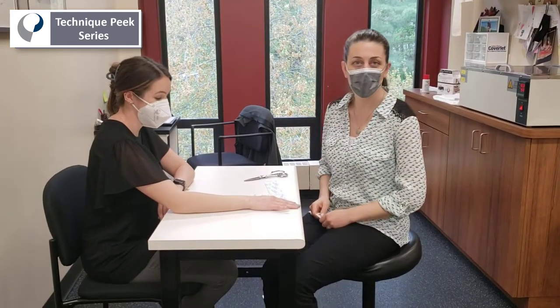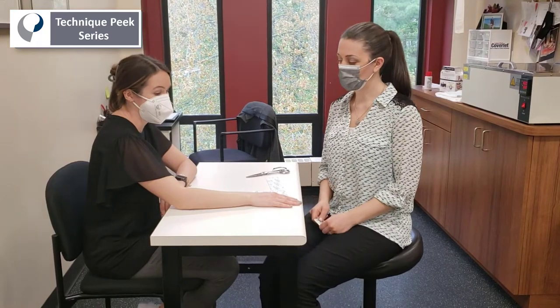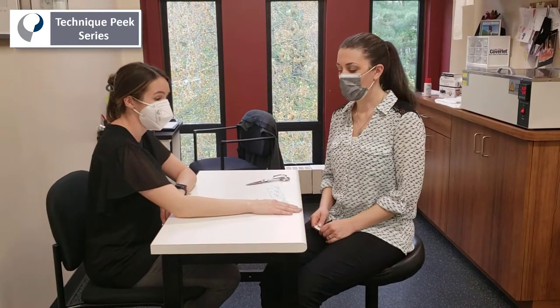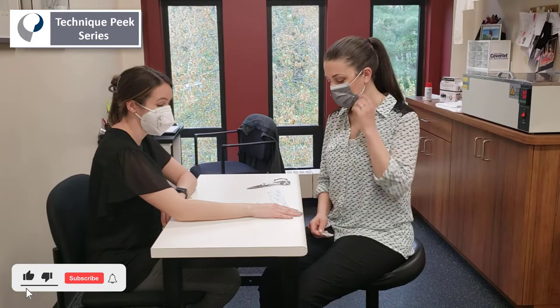Hello, today I'm going to show you how to do a kinesio taping technique that I use to treat pain associated with lateral epicondylitis. It's a good supplement to therapy — usually I'll do it towards the end of the session. I have a patient remove it about 24 hours before they're going to return so I can replace it.